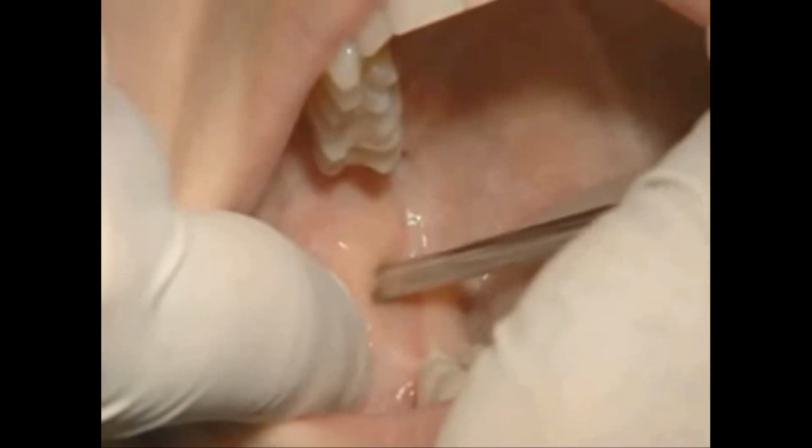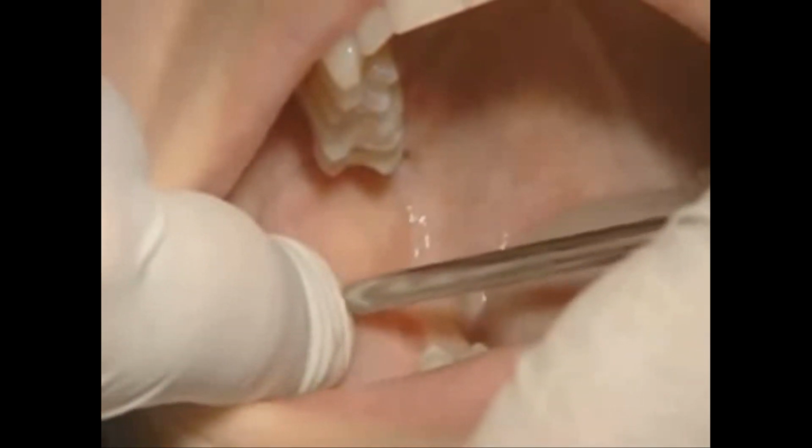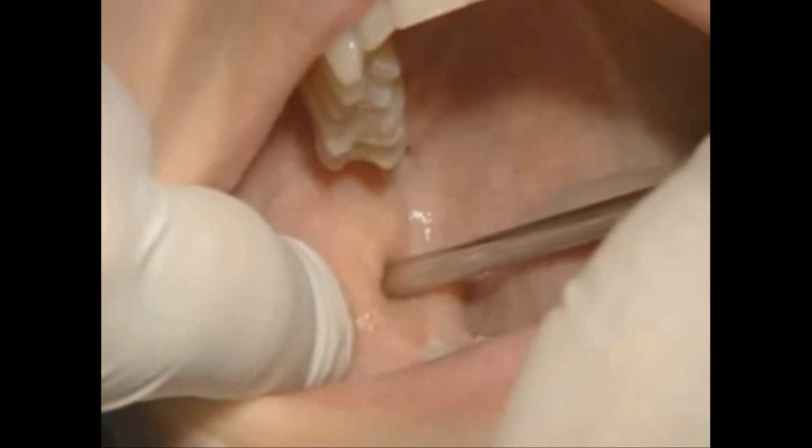lateral to the raphe. The height of insertion will be roughly the midpoint of your fingernail, anywhere from the midpoint to the height of your fingernail, and that determines the correct height of insertion.